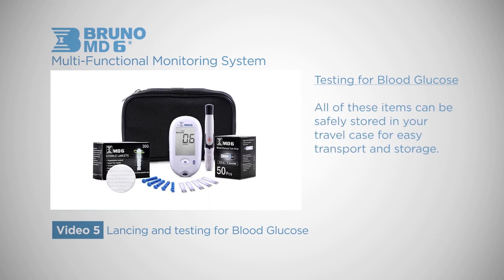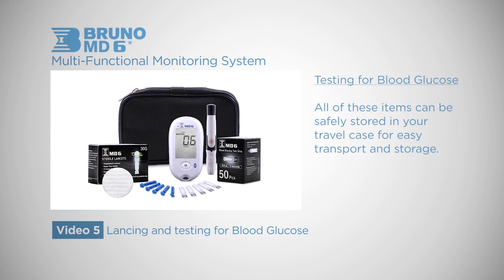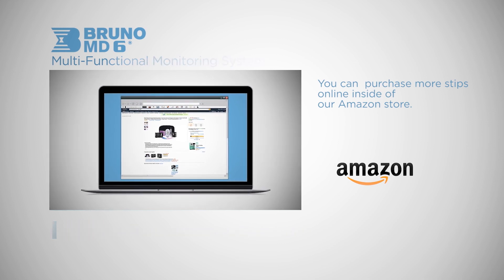All of these items can be safely stored in your travel case for easy transport and storage. You can find out more information online inside of our Amazon store.